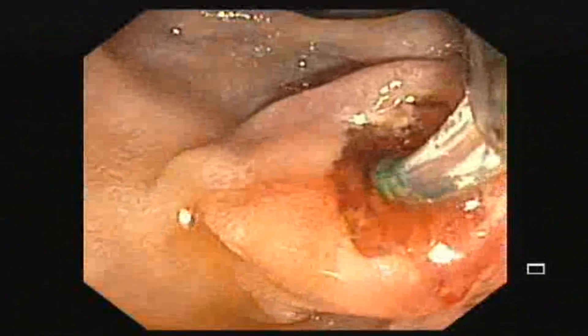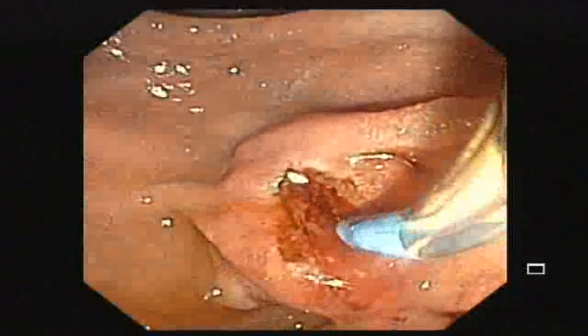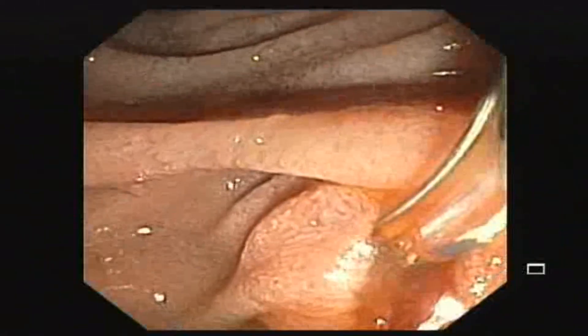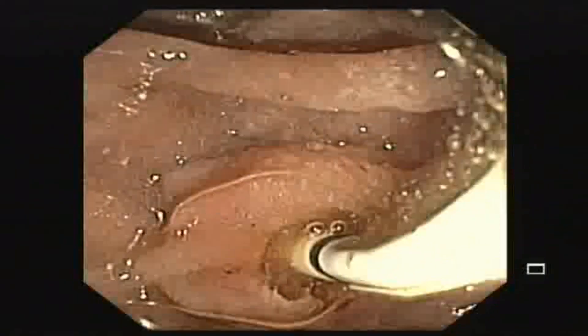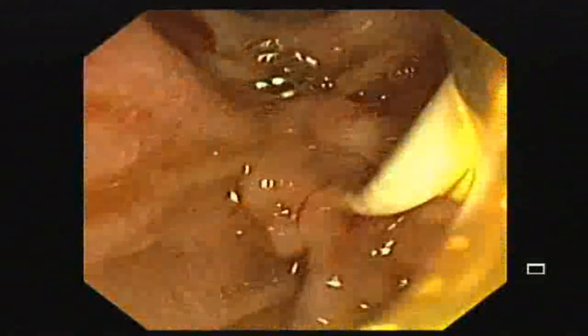After the papillotomy, we pass an extractor balloon to clean the CBD. The balloon was passed into the bile duct and inflated. We are then pulling out the extractor balloon to take out any stone or sludge.